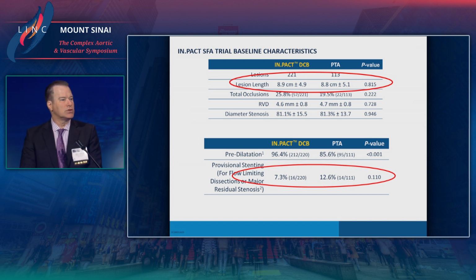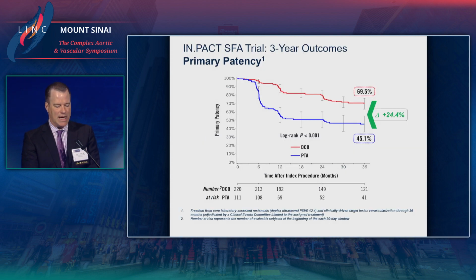When we look at provisional stenting within these trials, it's quite limited. Again, I think as a result of trial design, you couldn't really be randomized until you had no flow-limiting lesions, so provisional stenting was in 10% or a little bit less perhaps. And really dramatic results were identified in all 3 of the trials I'm just going to touch on.